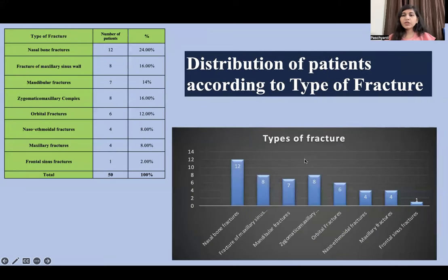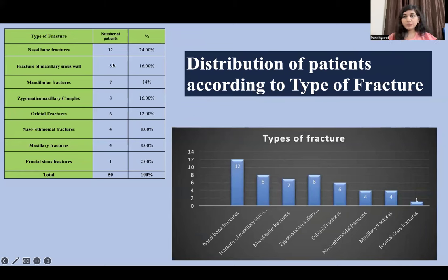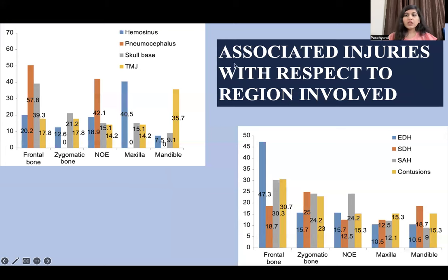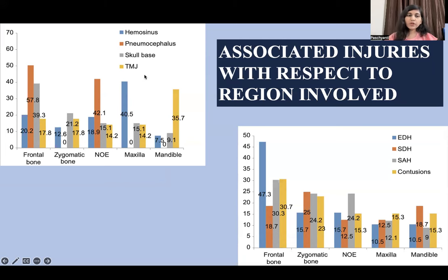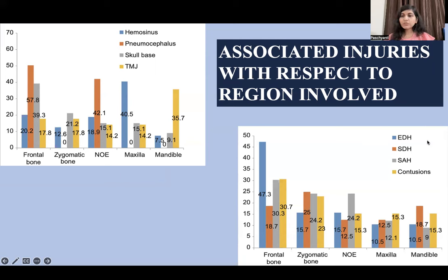Nasal bone fractures were most commonly seen in patients. Associated injuries with respect to the region involved include hemosinus, pneumocephalus, skull base fractures, and temporomandibular joint fractures. In hemorrhages, extradural hemorrhage, subdural hemorrhage, subarachnoid hemorrhage, and hemorrhagic contusions were observed.